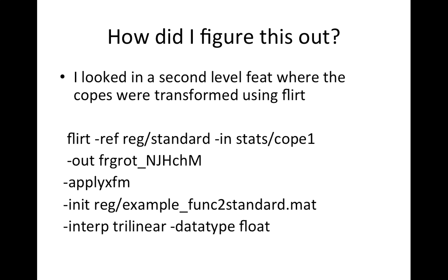So how did I figure out how to do this? I got some help from others, but the way to figure out what FSL is doing is to look at the log. I looked at the log of a second-level FEAT analysis and simply searched for the term 'cope' or 'flirt' and found the FLIRT command that was used. This is just a typical FLIRT call — the reference image is the space it's moving to, and the input image is the cope file from the level one analysis.